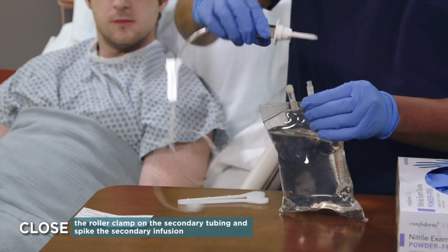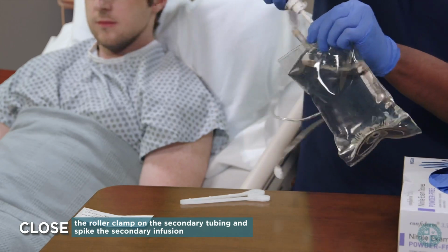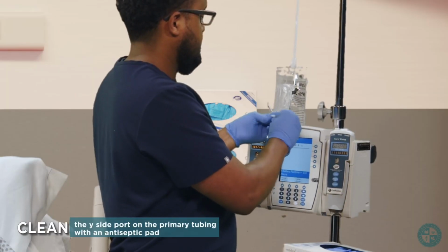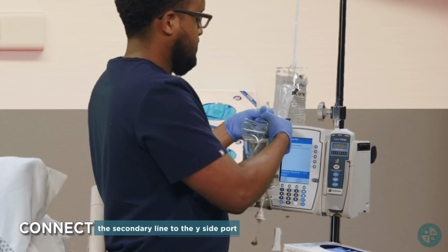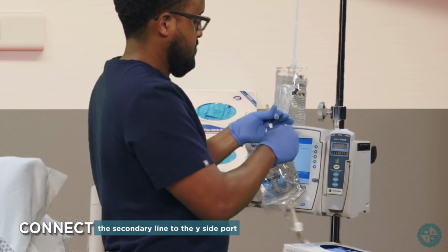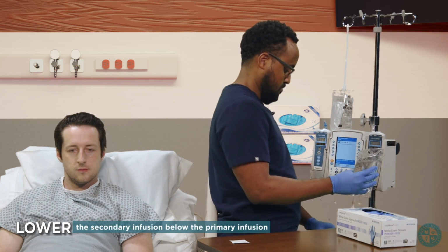Close the roller clamp on the secondary tubing and spike the secondary infusion. Clean the Y-site port on the primary tubing with an antiseptic pad. Connect the secondary line to the Y-site port. Lower the secondary infusion below the primary infusion.